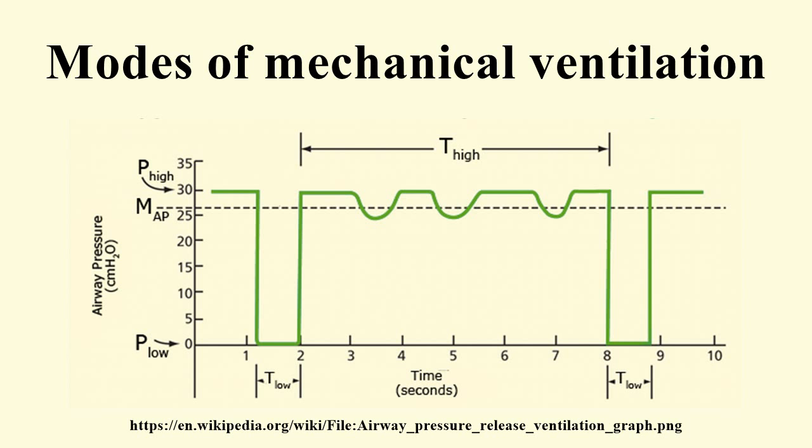Bilevel positive airway pressure is a mode used during non-invasive positive pressure ventilation. First used in 1988 by Professor Benzer in Austria, it delivers a preset inspiratory positive airway pressure and expiratory positive airway pressure. BPAP can be described as a continuous positive airway pressure system with a time-cycled change of the applied CPAP level. CPAP, BPAP and other non-invasive ventilation modes have been shown to be effective management tools for chronic obstructive pulmonary disease and acute respiratory failure.